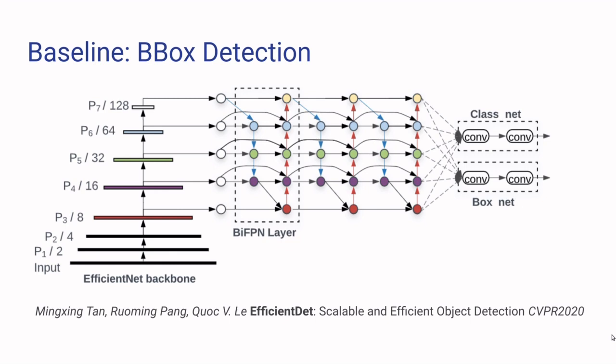In the end, I decided to use EfficientDet, because all the frameworks I tried reached equally good results out of the box, and EfficientDet has its own advantages as a recent state-of-the-art single-stage object detector.